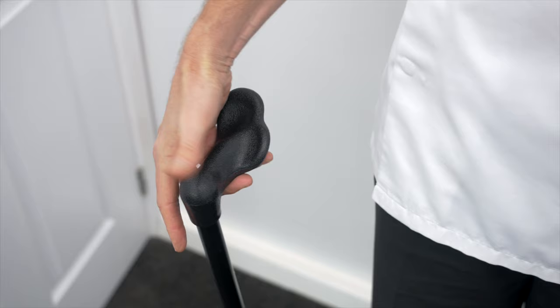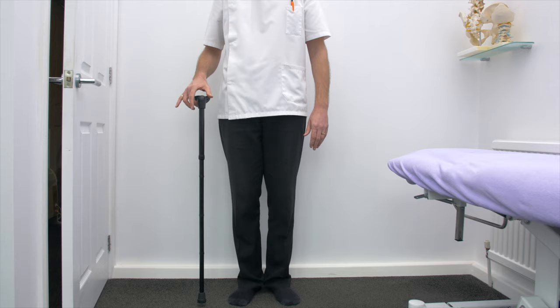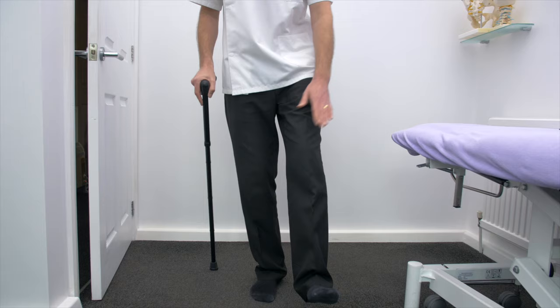So what is the correct hand to hold your walking stick in? You hold it on your good side. So if I have a bad left knee I hold it in my right hand. The purpose is I take the weight and pressure onto the right side.